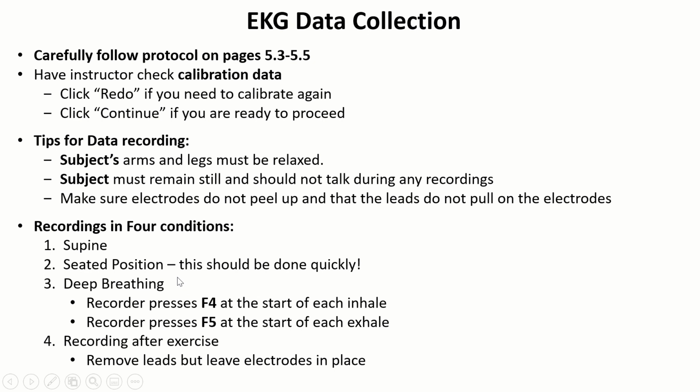It's important here that you watch the subject as they breathe in and breathe out. They shouldn't be talking. You should not be talking to them. Instead, you'll record each inhalation and exhalation by pressing F4 at the start of each inhale and F5 at the start of each exhale. This is going to mark the tracings collected in your EKG, and you'll come back to them when you do your analysis.